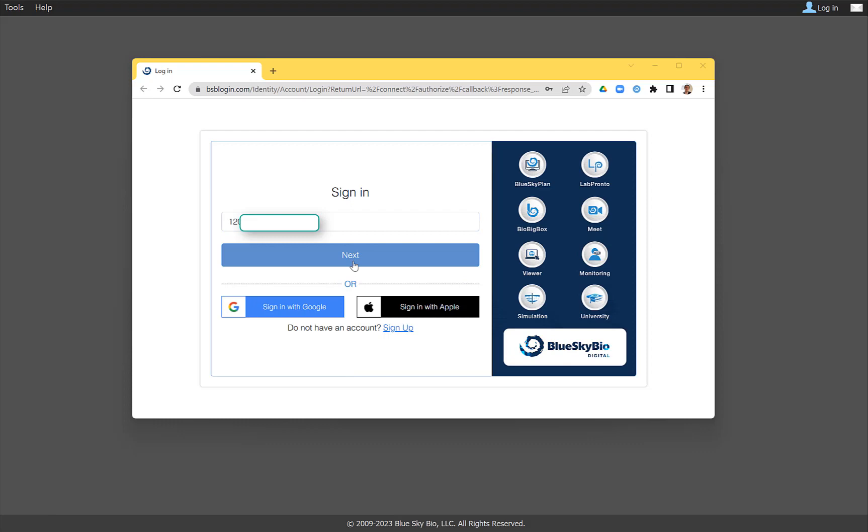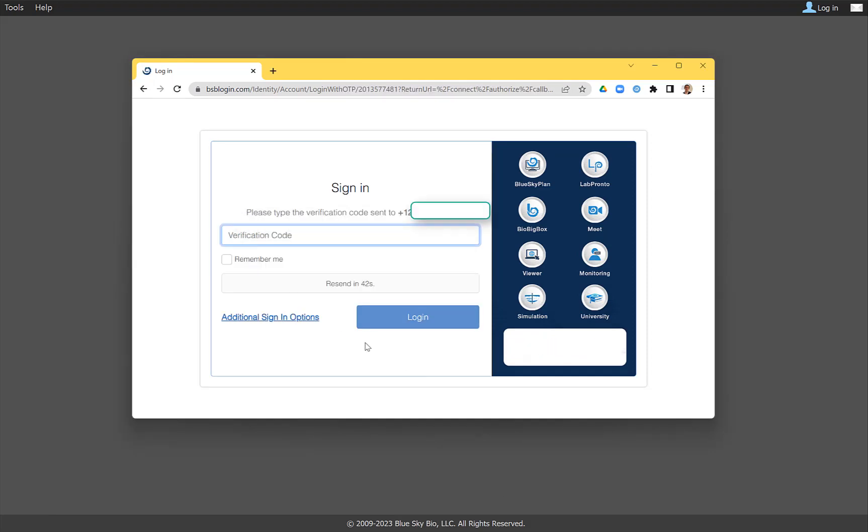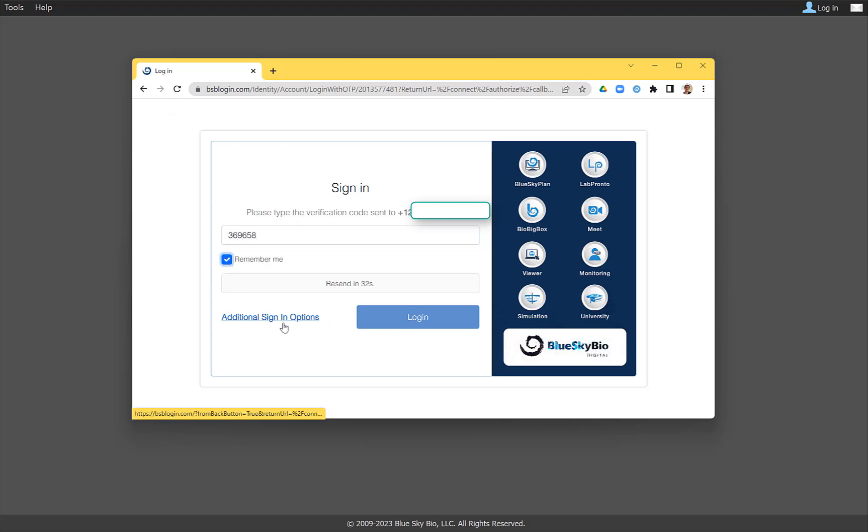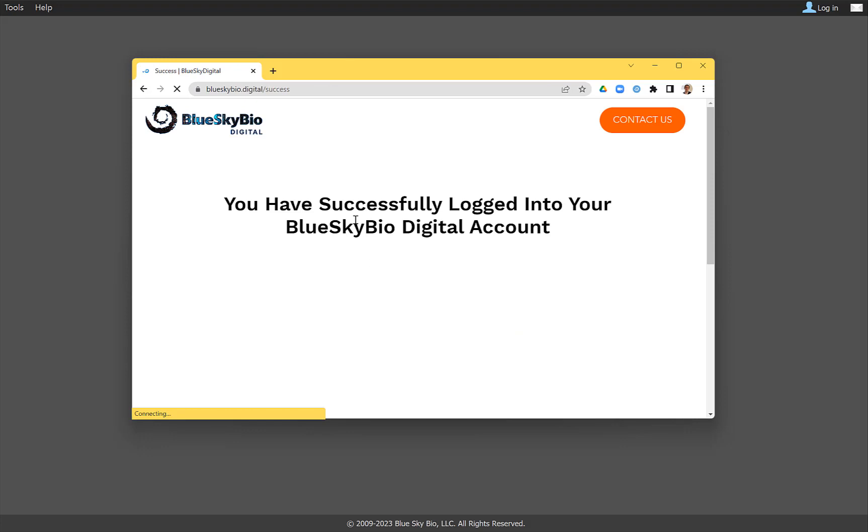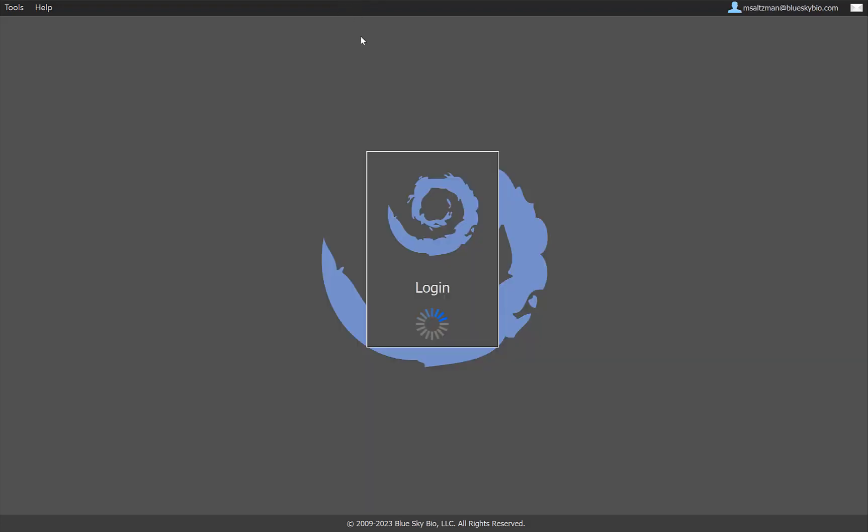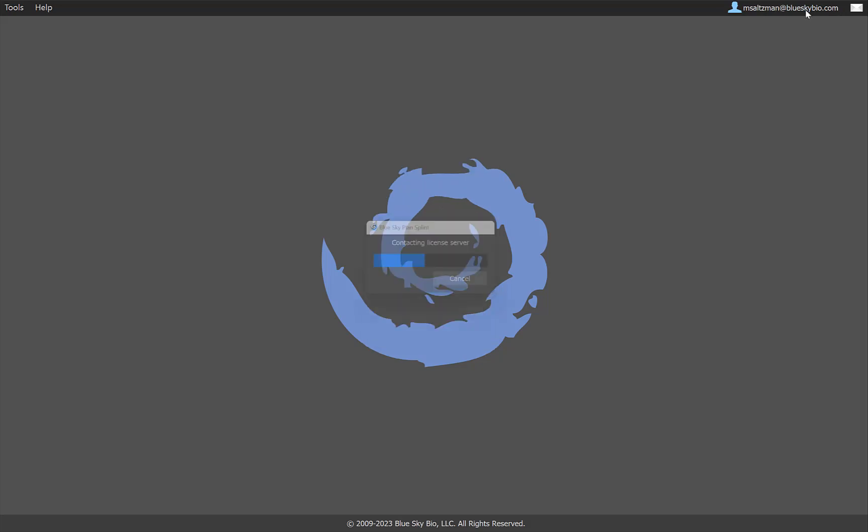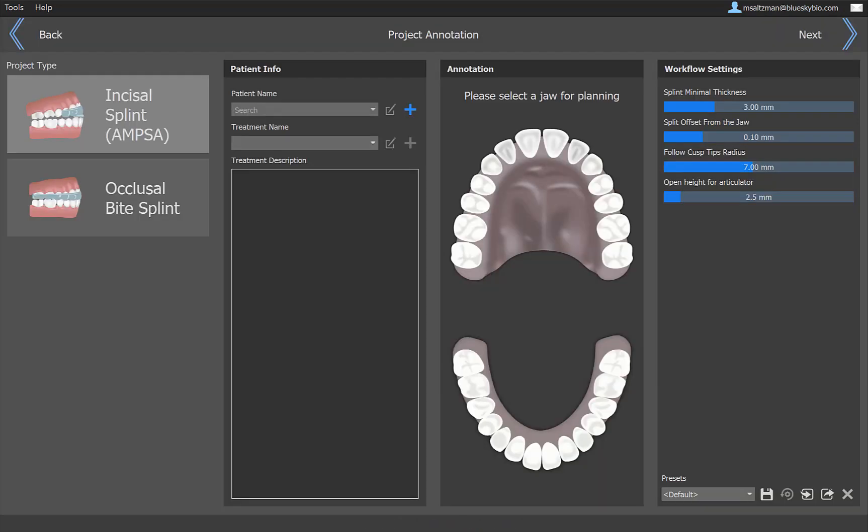I get a verification code sent to my cell phone, I put it in, and I'm good to go. And of course, the same login account gives you access to all of our Blue Sky Bio Digital products. I put in my cell phone, literally a second later I get my verification code. I put that straight in. I could click remember me if I want to stay signed in, and I could go back to additional sign-in options if needed. I'm now logged into my account and I could continue using Blue Sky Plan. I could see that I'm logged in. My email address appears in the top right of the screen.